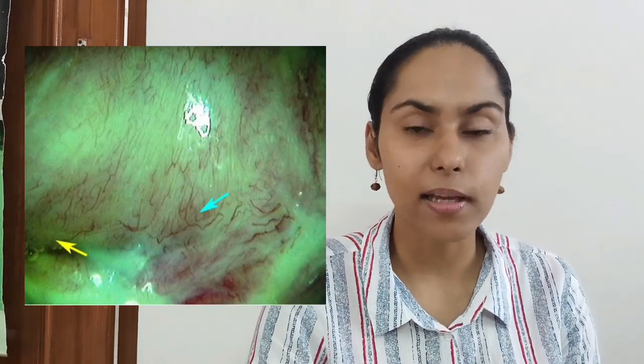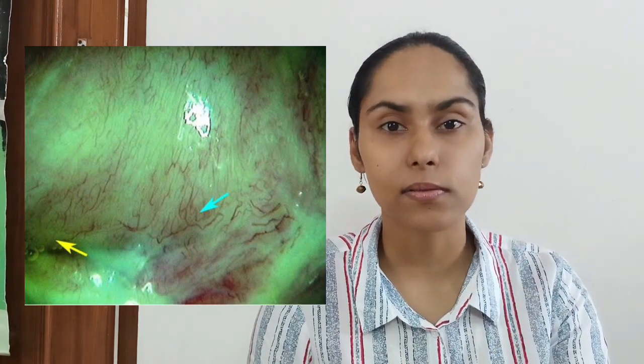So far we have positioned the patient, inserted the speculum, and noted findings on the cervix and transformation zone. Now apply normal saline, using a sprayer or gauze. Then switch to the green or blue filter and under 15× magnification examine the surface and vessels. This must be done before acetic acid, because acetic acid causes tissue swelling and edema that creates opacity, making vessels below the cervical surface less visible.